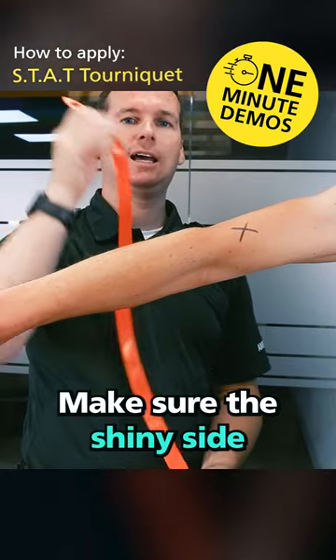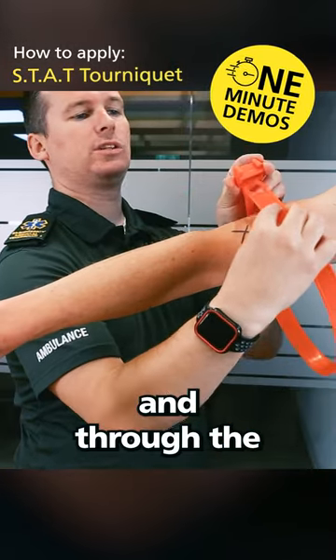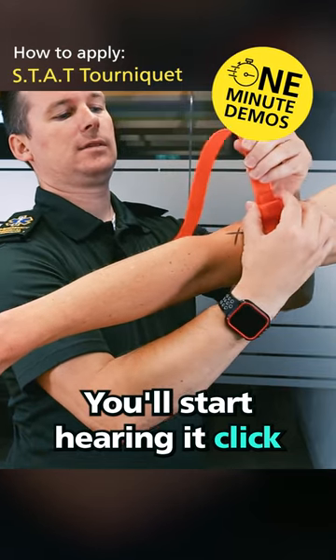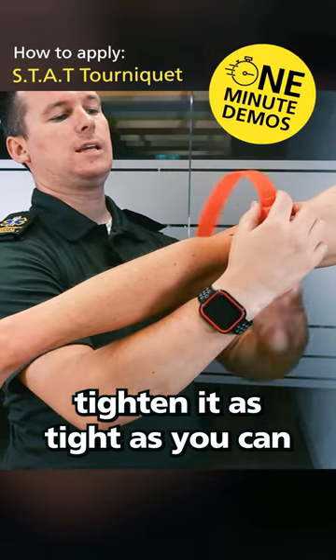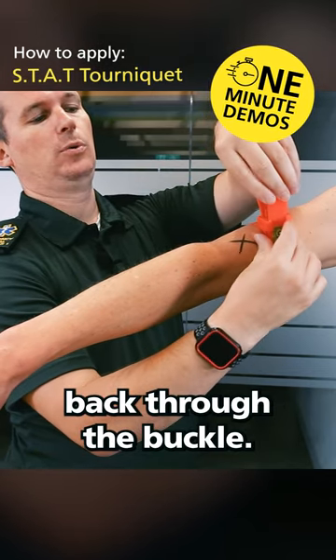Make sure the shiny side is towards the skin. Place it around the limb and through the self-locking buckle. You'll start hearing it click. Tighten it as tight as you can and then place this end back through the buckle.